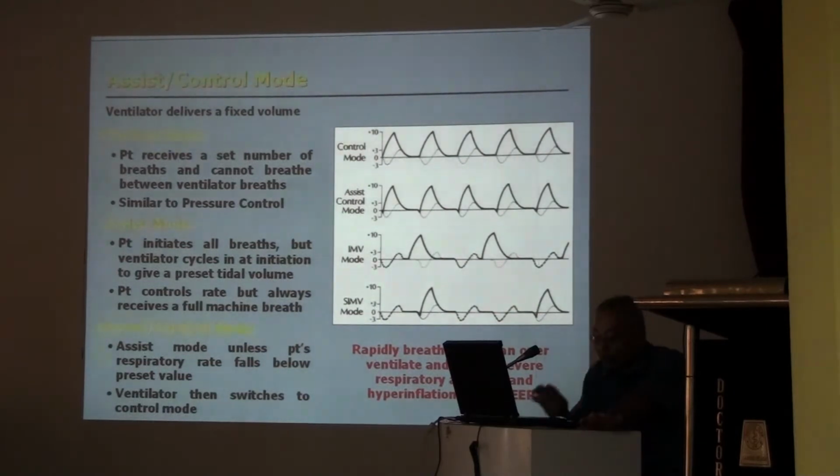Okay? Now again look at this curve. When this mechanical breath has been delivered here, what is this phase? This is actually the exhalation phase. That means I am exhaling some air and the machine is delivering into me. So there will be fighting between my exhalation and the mechanical delivery of the breath. Now there will be a clash. So IMV is not good for me.